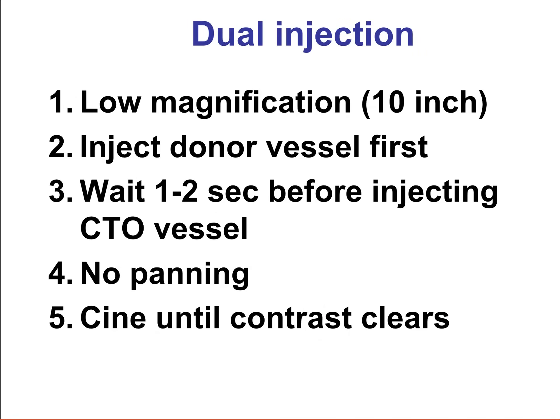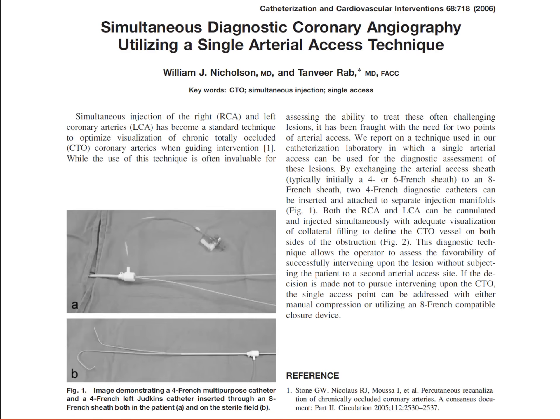How can dual injection be done? First, we like to use low magnification in order for the entire coronary tree to be included in the image. Second, we inject first the donor vessel and wait a couple of seconds before injecting into the CTO vessel itself. We do not pan during the injection and we wait until the contrast clears before we stop the cine angiogram. Bill Nicholson reported a technique in which an 8 French sheath is inserted through which two 4 French diagnostic catheters are advanced, engaging both the CTO vessel and the donor vessel, allowing a dual injection with a single arterial stick.